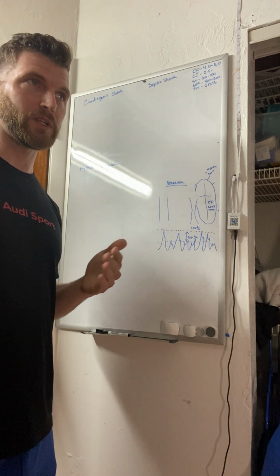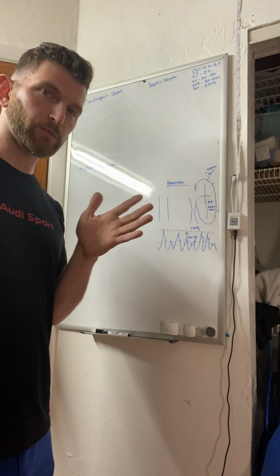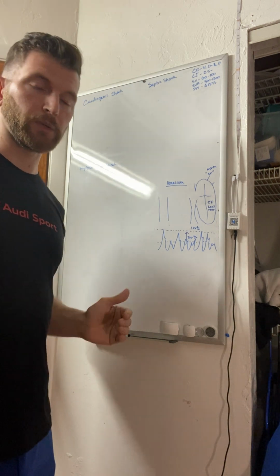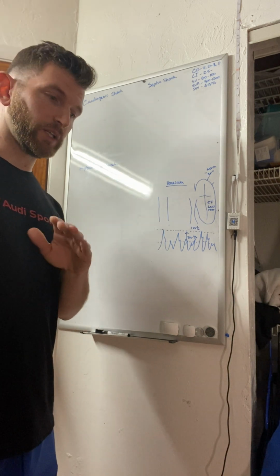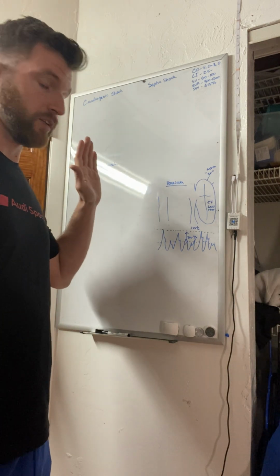If they're not well sedated or not paralyzed, or they're breathing over the vent a little bit, some of these numbers may be off. Now, if those numbers are extremely high or extremely low, there may be some validity to them, but once again, use clinical factors, clinical interpretation, and clinical evidence to define those numbers.